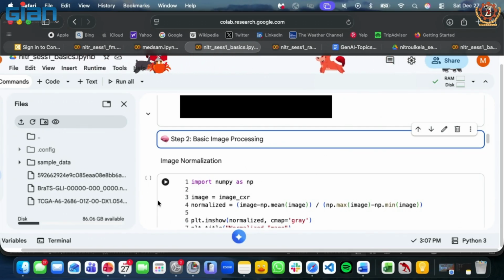Different scanners will have their own variations. Different institutions will have different scanners. The age of the scanners also matters depending on some studies. So, multiple factors. If you want to train an AI model with this diverse data, the model might get confused. So the best approach is to do some data normalization and then feed the data.